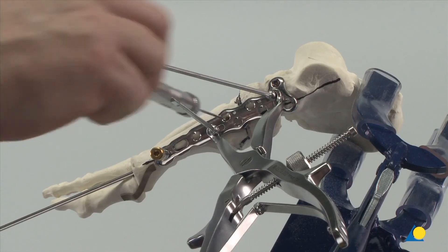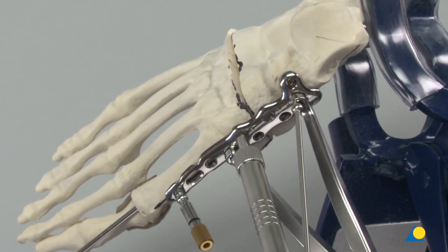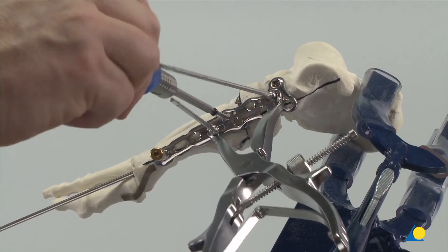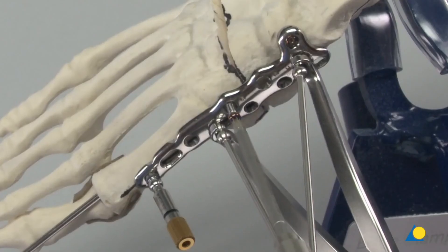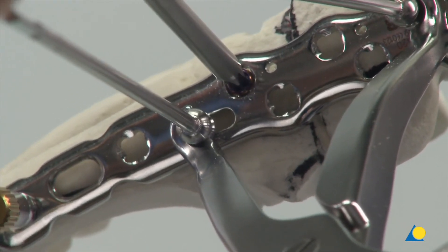The correct screw length is measured with the depth gauge. The screw is inserted with the star drive screwdriver shaft and handle. Final tightening is made with the torque limiter.